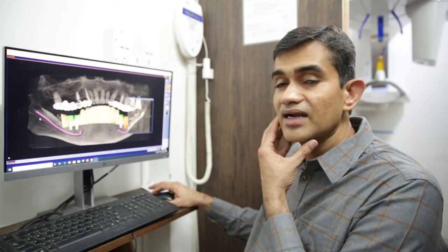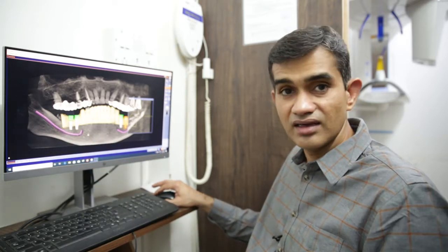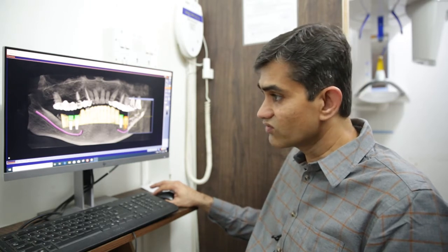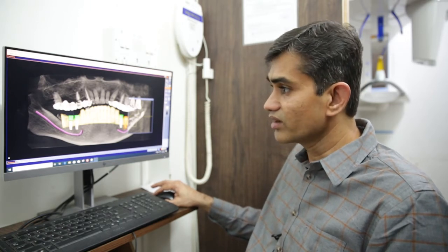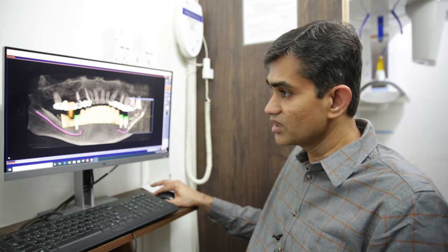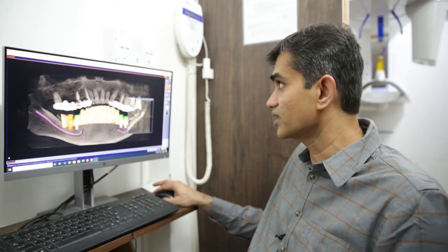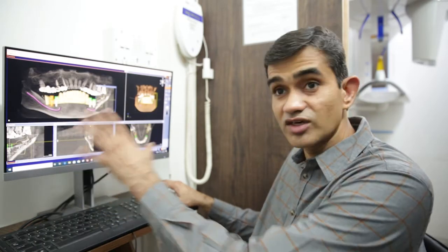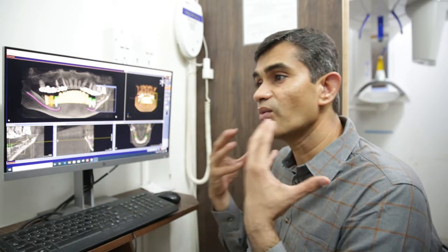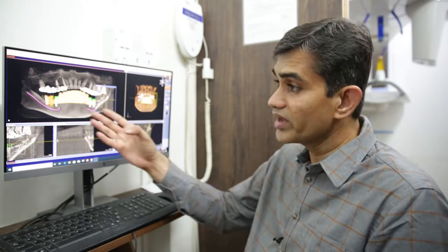Here we use something called the Galileos implant planning software, where we can virtually plan the entire surgery. You can see the mandible. The mandible has something called the mandibular nerve, which is seen there. We can draw the nerve, and we can also place virtual implants. You can move the implants and see where they are going to be placed — so we can virtually plan the implants.